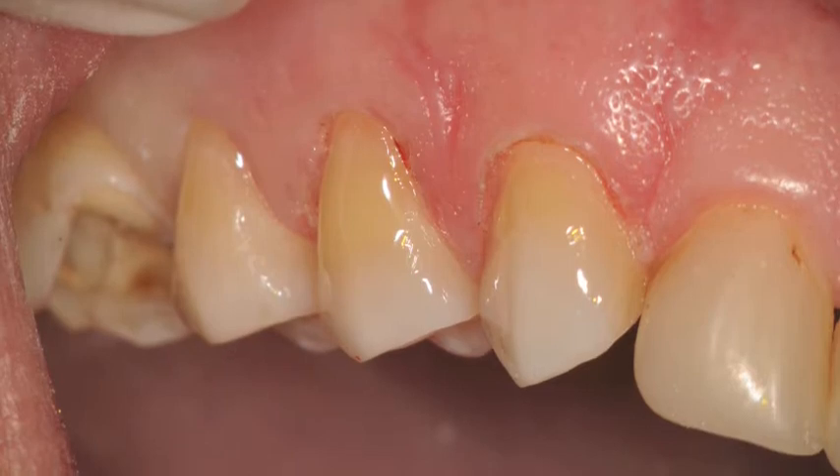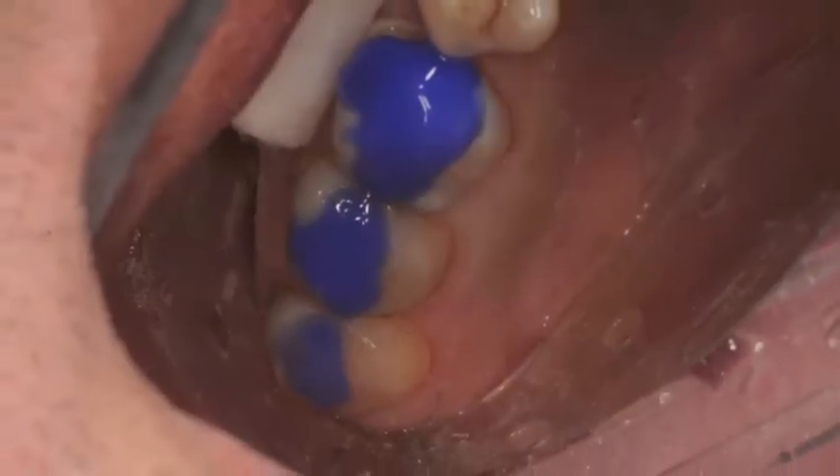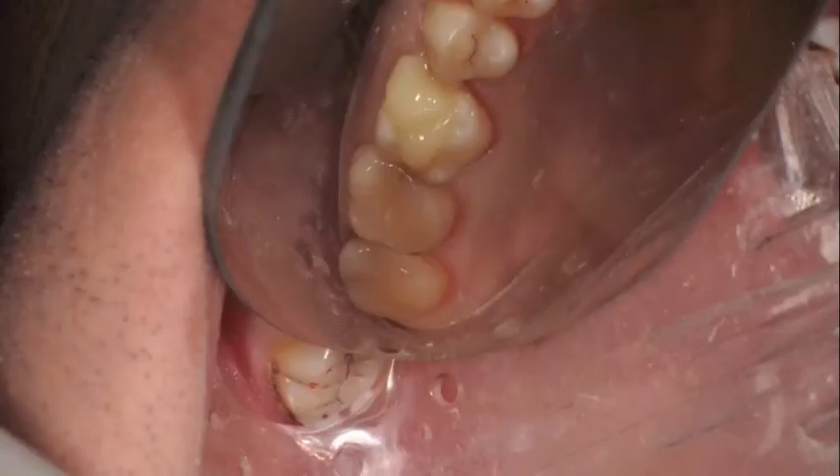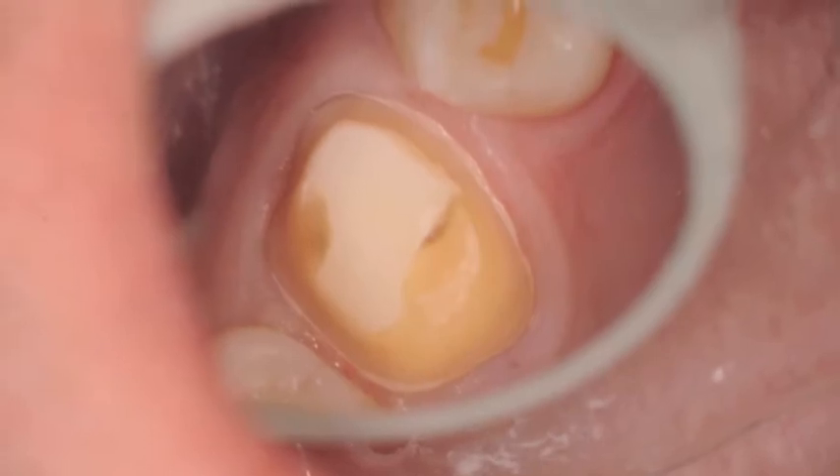You can see the gingivectomy done there. Etching was placed. You can see the Isolite core buildup and resin restorations. The crown prep completed here for a labial crown.